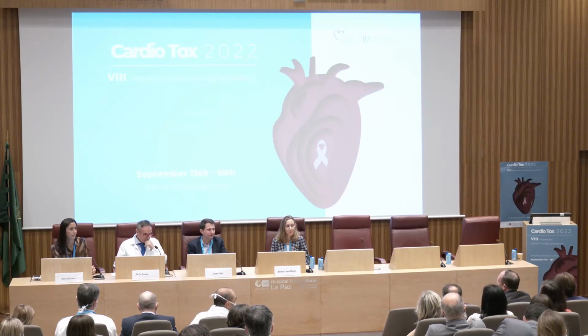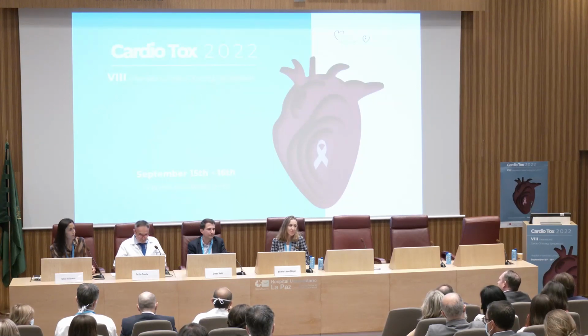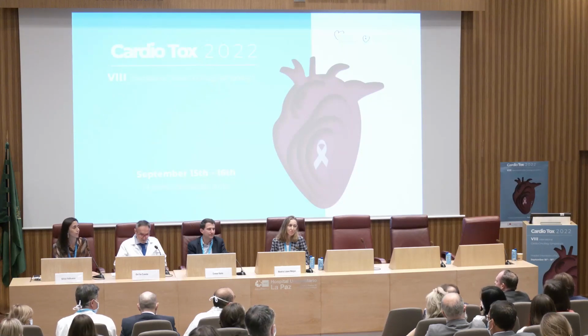So I think the biggest advantage of MyoStrain is actually going to be the negative predictive value of reassuring people on cardiotoxic treatments that they can stay on them safely. And then if a change does occur, it's a little bit like what happens if a biomarker rises. We need closer monitoring, then there's a clinical decision. Some patients may need treatment, but not everybody. And we can just have closer monitoring. So I think this technology is going to become a new part of the armamentarium of modern cardiology and cardio-oncology.